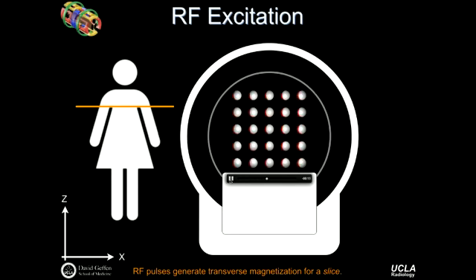You'll notice that they're precessing, of course, at the Larmor frequency, but they're also caused to rotate over because that RF pulse exerts a torque on the underlying spins. And so we can generate so-called transverse magnetization with an RF pulse. This is in the absence of thinking about or looking at anything related to relaxation, for example.